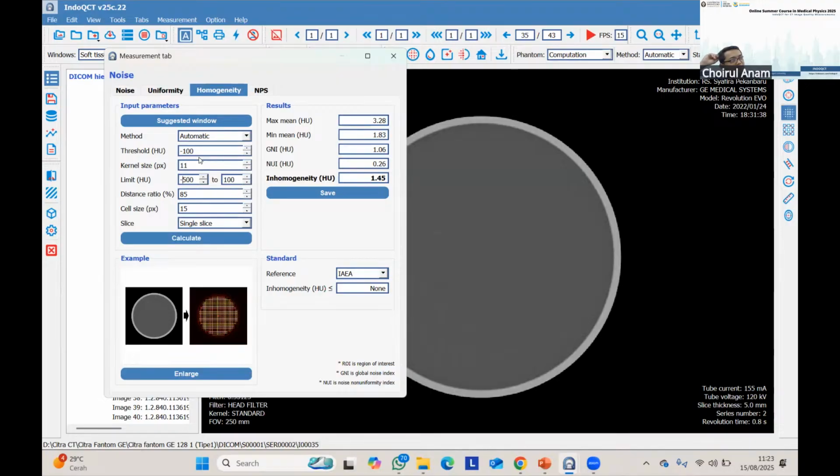I think in Medical Physics, they use three-dimensional ROIs in a circular position, and then locate them in different locations. So there are many techniques to make the ROI. Basically, there is no standard, but using more ROIs is better. But using only one ROI is enough, of course.